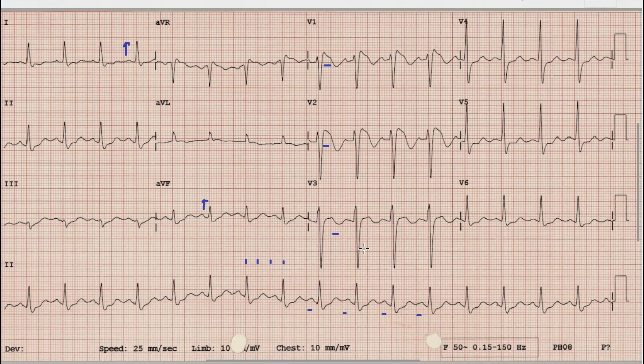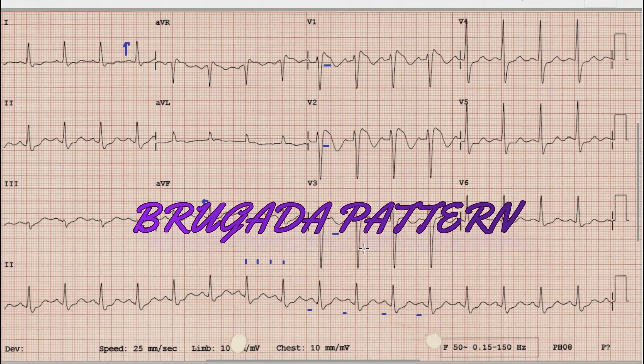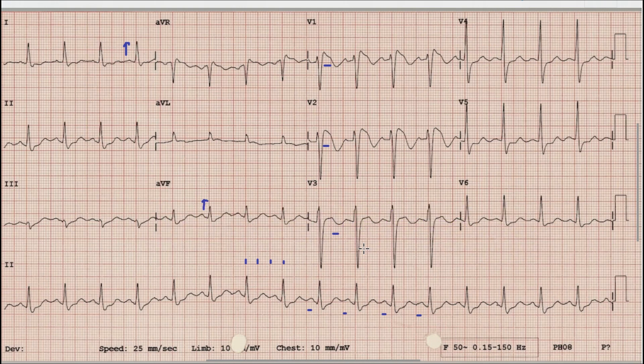Whenever you find a young patient without chest pain and an ST elevation which is coved upward followed by T wave inversion in V1, V2, or V3, always think of Brugada pattern. Brugada pattern is a rare inheritable condition which presents on ECG as coved upward ST elevation followed by T wave inversions in leads V1 to V3.